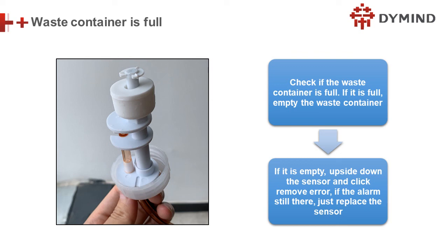By what? By multimeter. We can turn this sensor upside down and then check if the alarm is there. And also, we can use the multimeter and check if it's conducting. There are two sensors, upper and lower. If they conduct, that means the sensor is good. Okay.